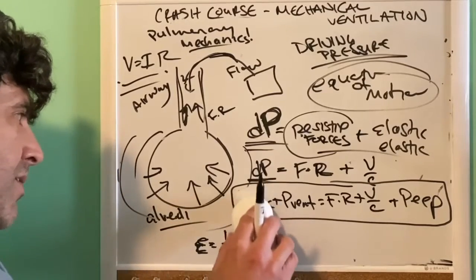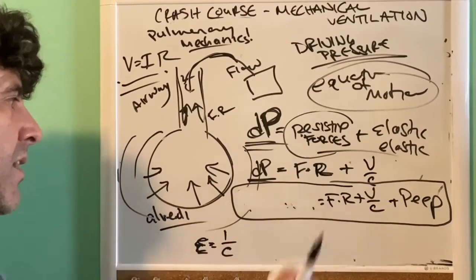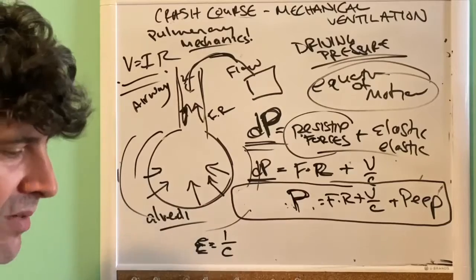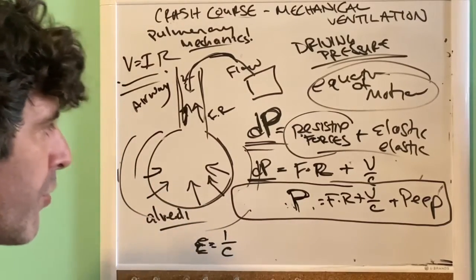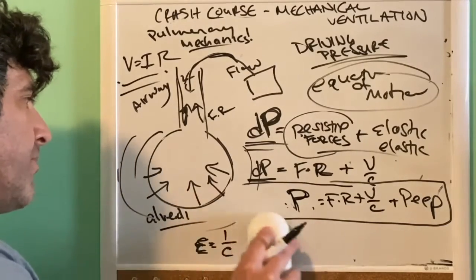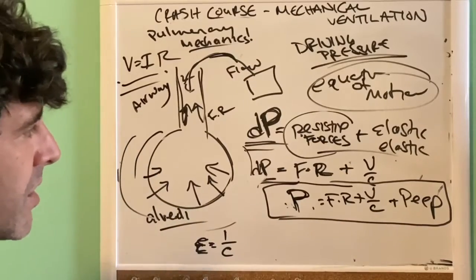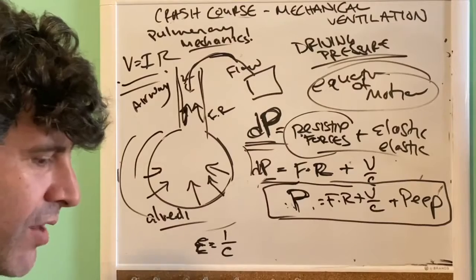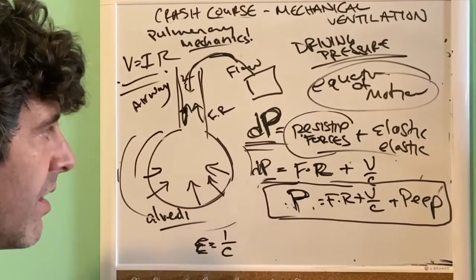So we're just going to take that out. Essentially, we're just dealing with the pressure of the vent. We can look at it like this. Later, when we talk patient-ventilator interaction, remember that the pressure that's required can come both from the patient's muscles and the vent. So here's our equation, and this is an all-important equation, and you can start to see how the pulmonary mechanics change with any kinds of changes in the vent.